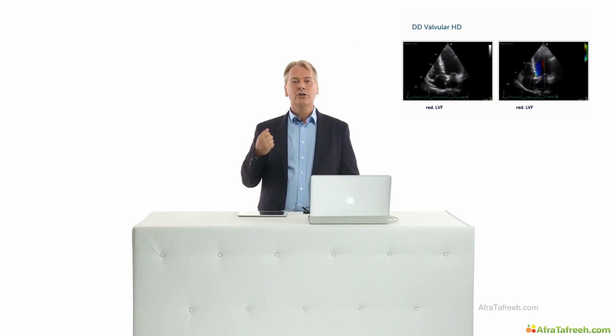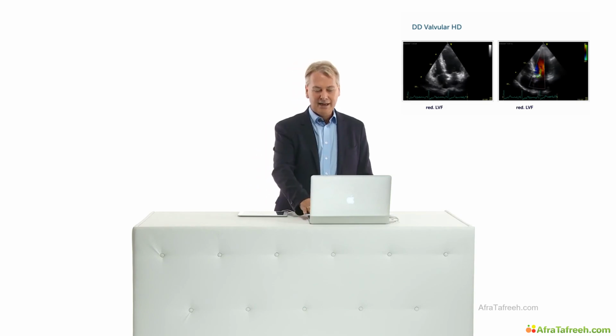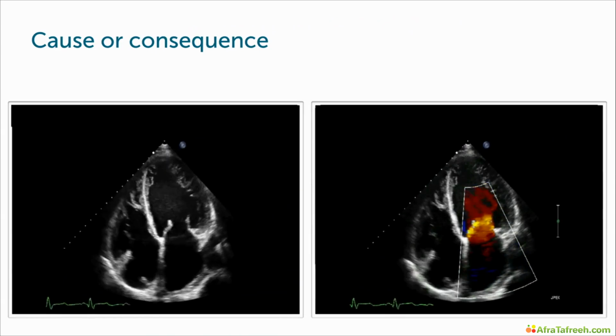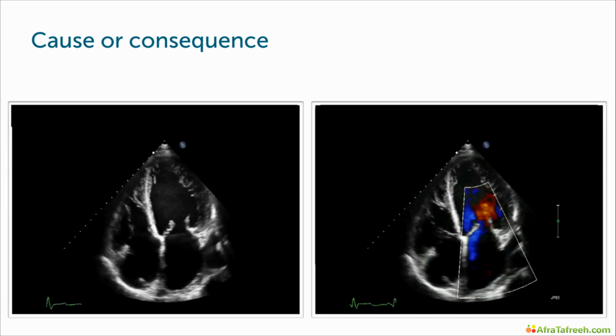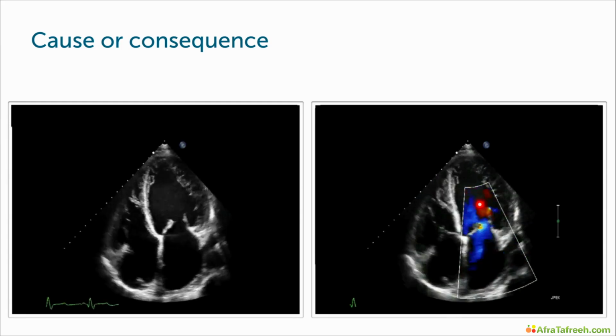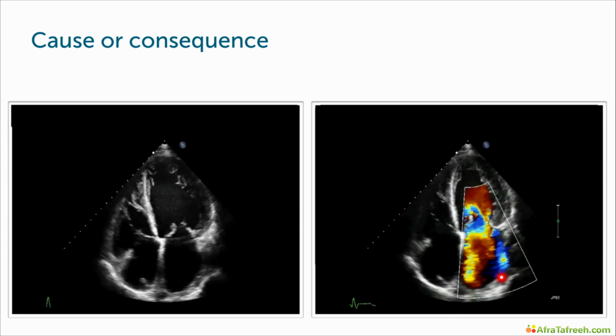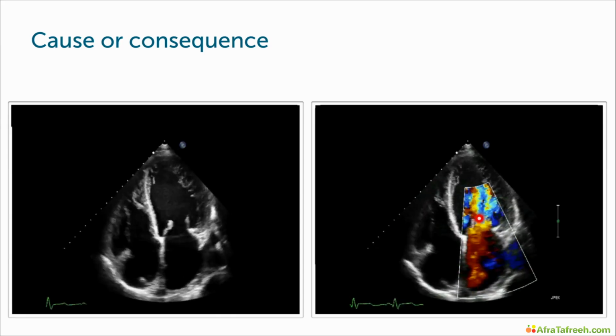And it's not only aortic regurgitation that presents a problem. More frequently, it is mitral regurgitation. Here's an example of a patient who has a dilated left ventricle and where we have massive mitral regurgitation, huge flow convergence zone, and an eccentric jet that we probably also underestimate with respect to its severity.